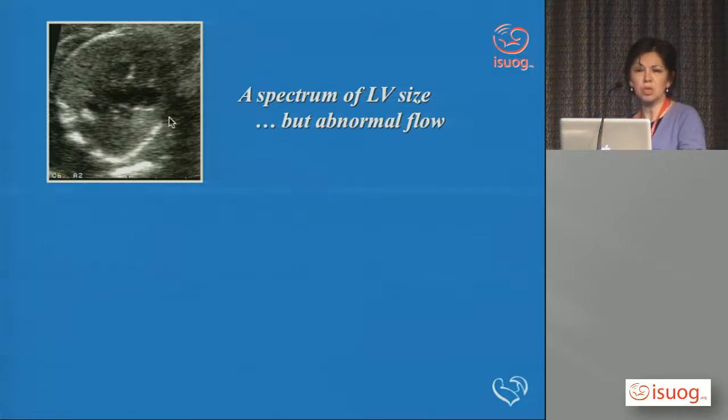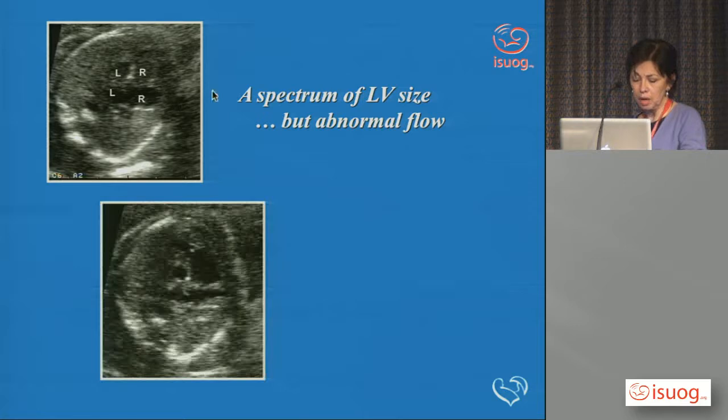I managed to see the 4-chamber view. And that could pass, right and left. Maybe a little bit there you say that there is mild disproportion, maybe under the conditions, baby moving. So that could pass potentially as a normal scan at 20 weeks.